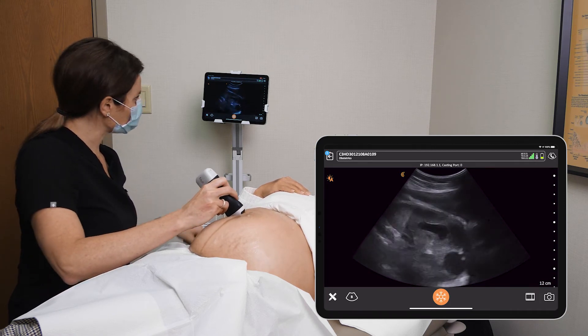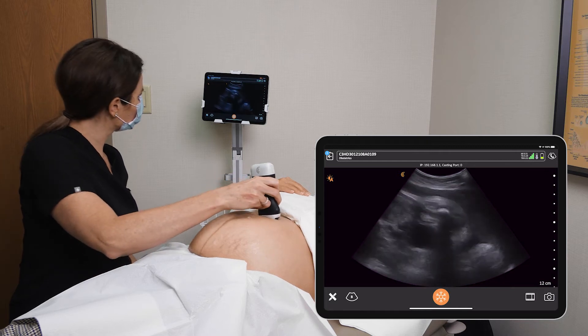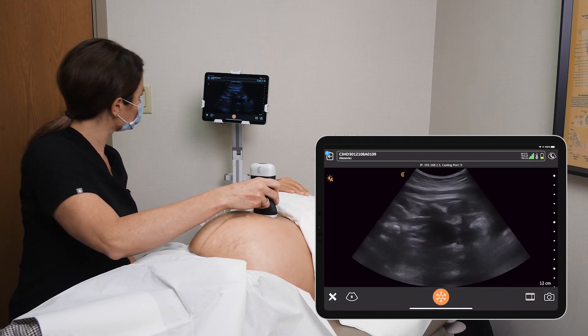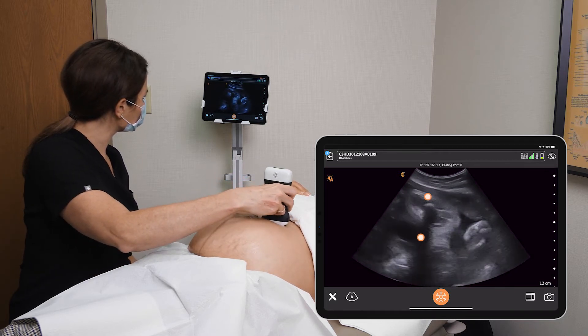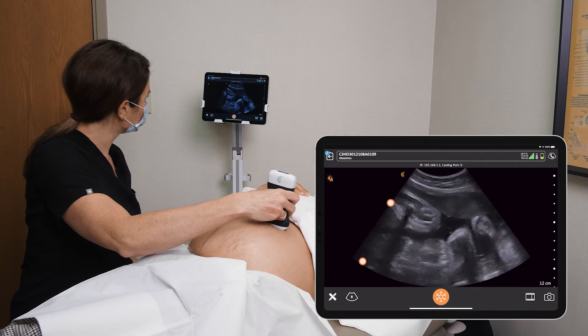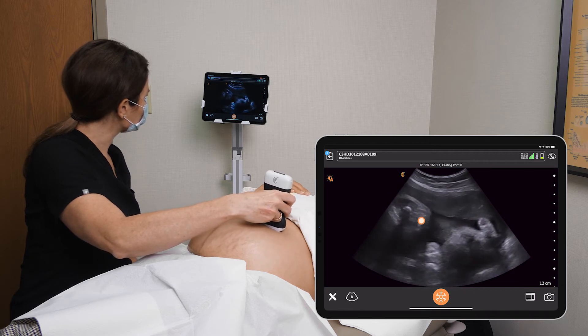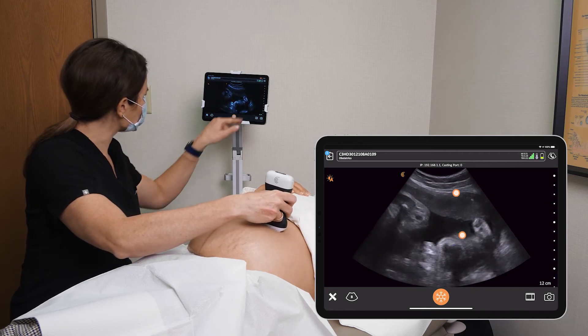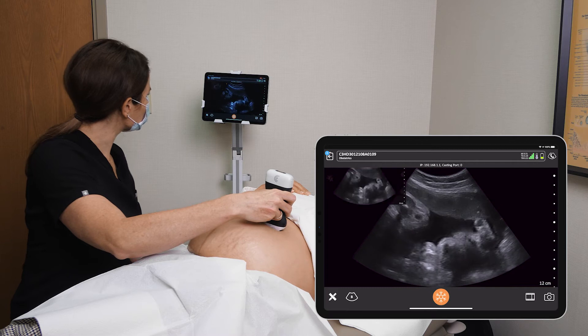Scan around — you can see baby's legs up here. There's a nice fluid pocket. You can see the placenta anteriorly as well. Take a picture there.